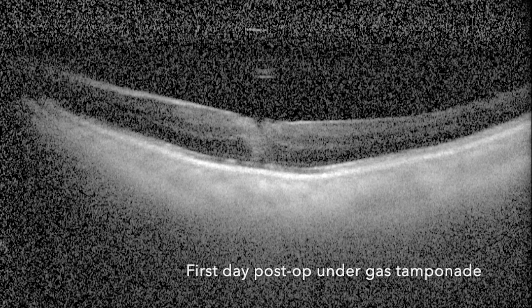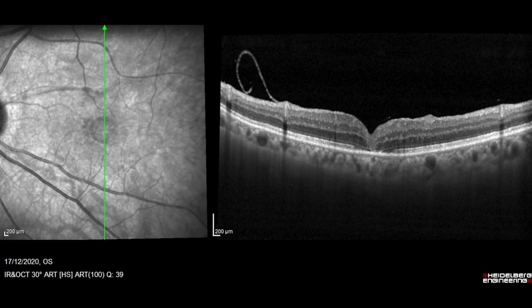This is the first day post-op under gas. You can see that the macular hole is already closed. At one week post-op, the best corrected visual acuity is already 0.5. You can see that the flap is still there and the macular hole is closed.